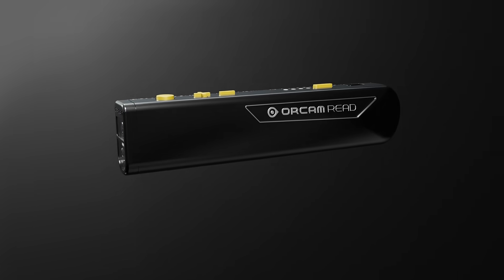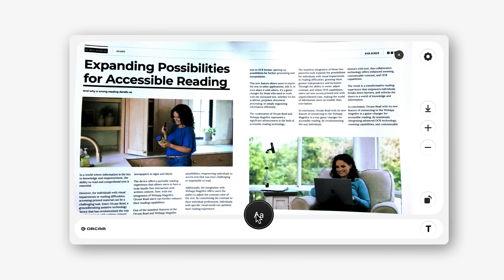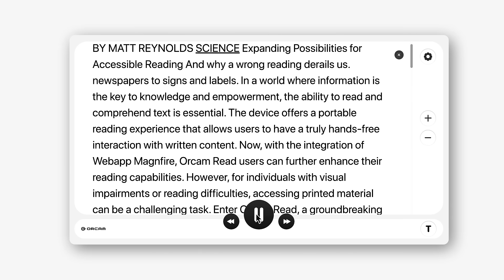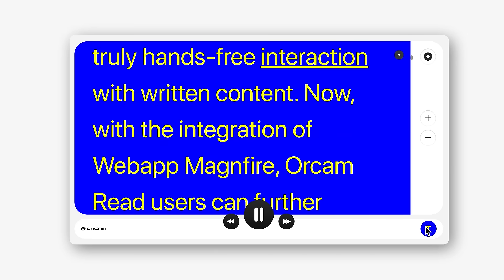Powered by this amazing handheld device that uses a sophisticated visual sensor to transform any text and images into a highly customizable live feed viewing experience. OrCam Read 3 puts you in control of your reading experience.